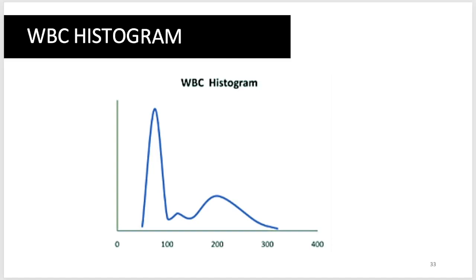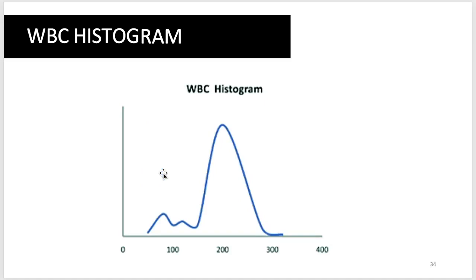Of course, again, check muna kung anong volume natin. Oh, nasa 50, 35, tapos nasa 90. So, this range is your lymphocyte. Tapos, mababa yung other parameters. Nag-peak lang siya. So, therefore, this is lymphocytosis. Very good.